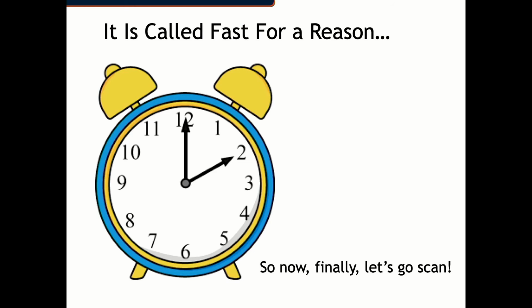Remember, it's called FAST for a reason. Based on guidelines, you have a maximum of 5 minutes. A lot can happen to a patient in 5 minutes. When you work in the emergency department, they are going to request that you scan this in less than 1 minute. So you really need to get what you can get as nicely and pretty as you can get it, worrying much more about the diagnostic quality and much less in this scenario about the image quality, as much as it might pain me to say that.